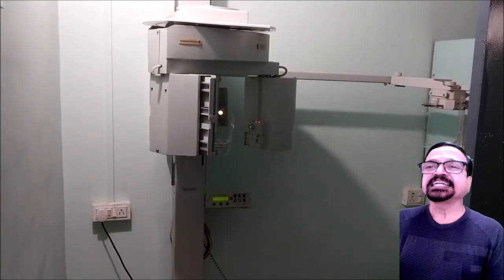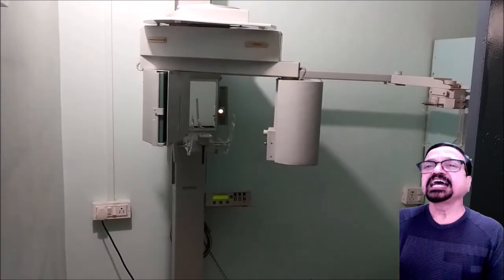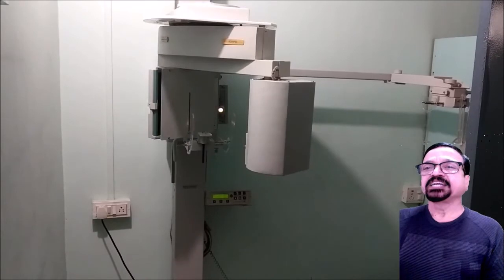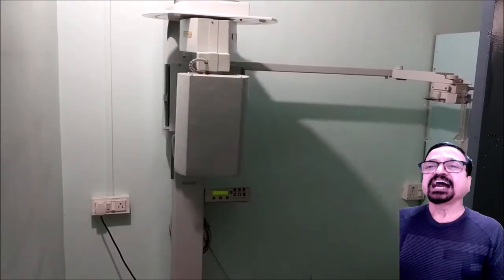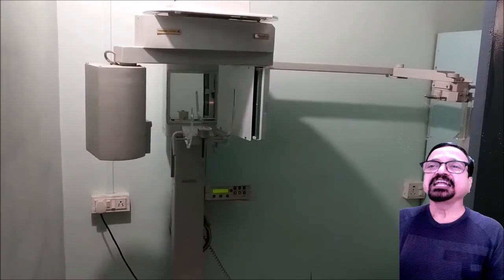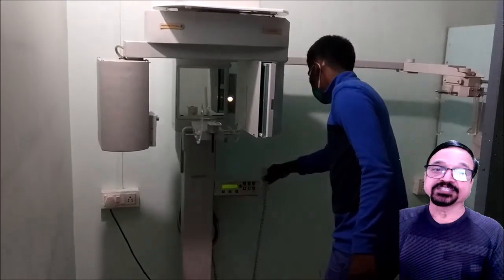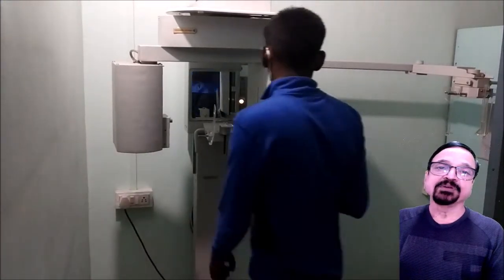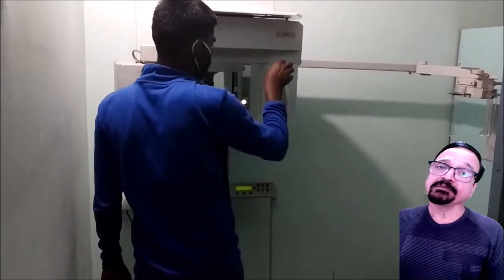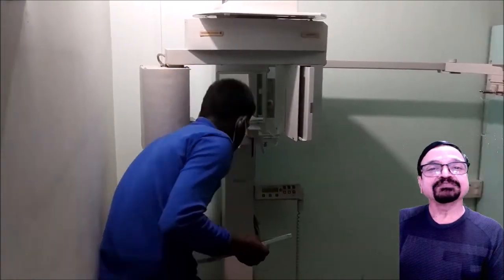Now the cassette is coming back to the position, the machine is coming back to the position, and then only you can remove the cassette. So all these things are essential for getting an O.P.G. Now details of the physics, details of the mechanism, details of how it produces images free of cervical spine are covered in a different lecture and on different videos extensively.